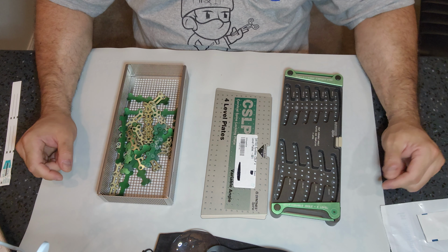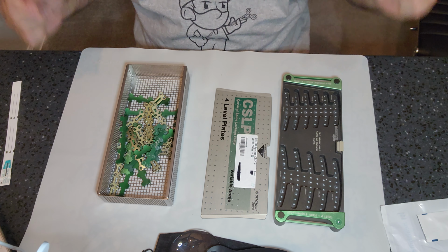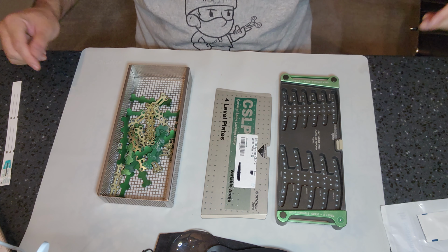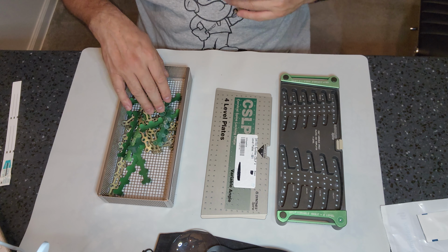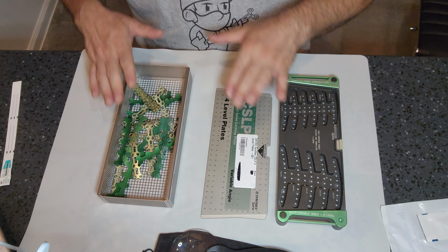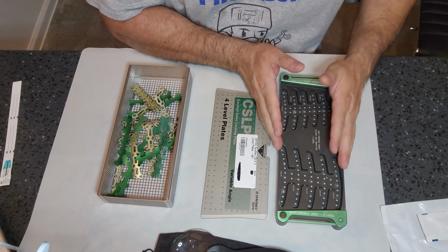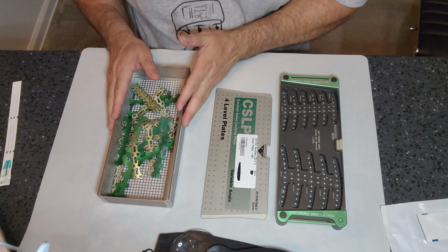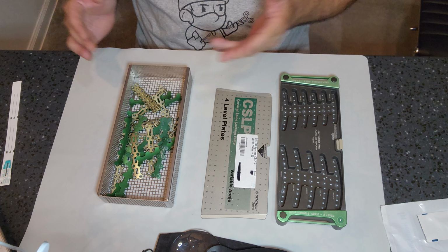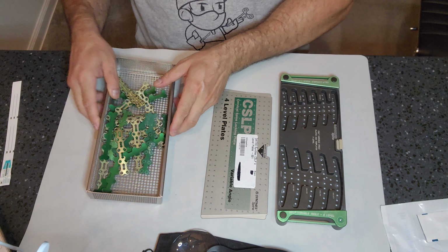What do you do as a central sterile processor? Guys, we're going back to basics and we're in the prep and pack side with a stir the pot twist. Decontamination followed the IFU of this manufacturer's tray. They cleaned the instrumentation in a basket separate from the original container. That is a must. But this is an easy tray, right? So it shouldn't be too difficult for us to prep and pack it, right? So what is our process here?